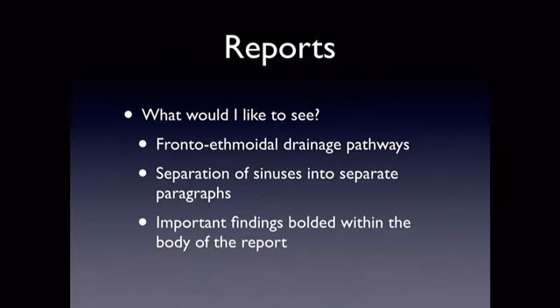So hopefully you guys have got an idea of how we look at scans, how we use them. We do actually spend quite a lot of time poring over them and creating that 3D picture in our head, particularly for people like Ben and I, where we're operating against dura, against the carotid, and things like that. It is really very important to have quite high quality scans, and I'm certainly very lucky to have Mitesh and Jenny to assist me.